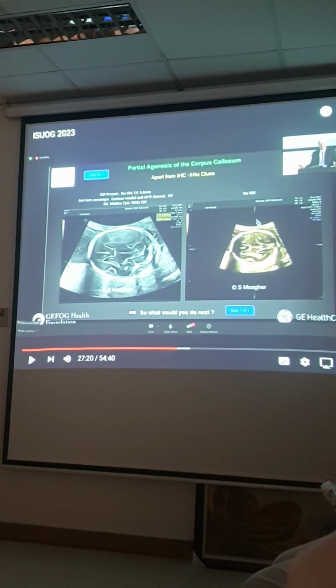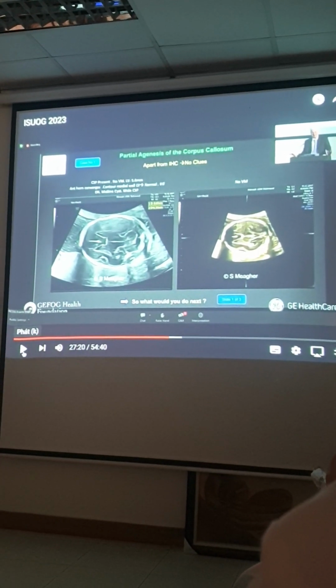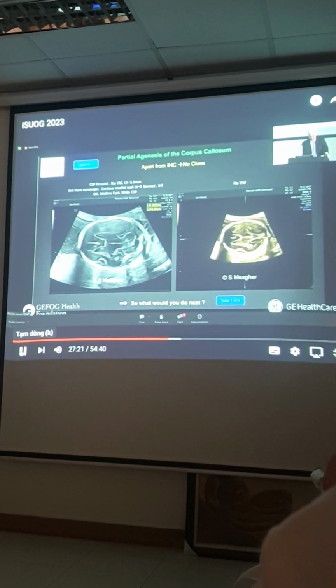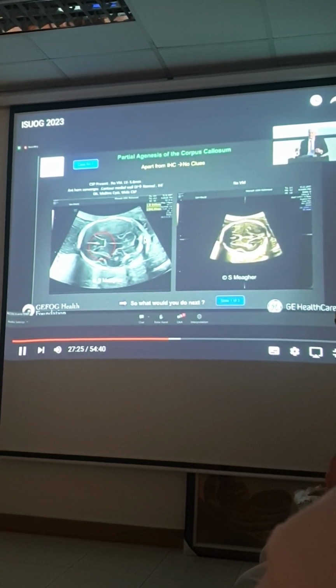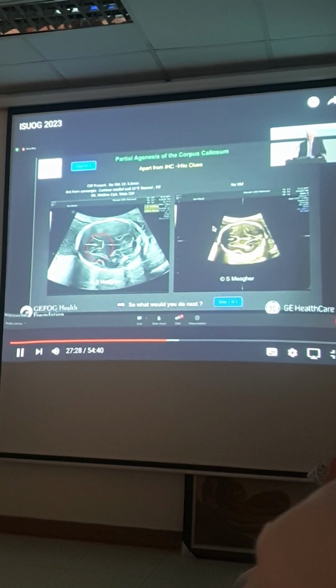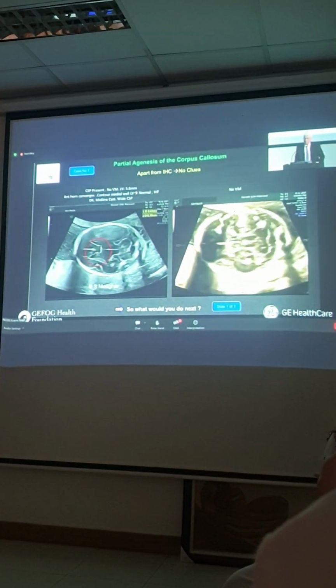Còn bây giờ những cái này thì nó sẽ có cái chiều dài này nó ngắn hơn cái chiều ngang, cho nên nó sẽ lấy cái tỷ lệ này. The CSP when you look at it is wider than usual. In fact, the width of it is more than the anterior. Nghĩa là bình thường nó giống như cái hình chữ nhật, nó nằm ngang. Bây giờ nó xây dựng ra.